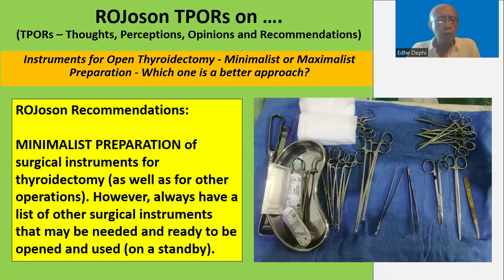ROJoson recommendation: minimalist preparation of surgical instruments for thyroidectomy, as well as for other operations. However, always have a list of other surgical instruments that may be needed, ready to be opened and used on standby.